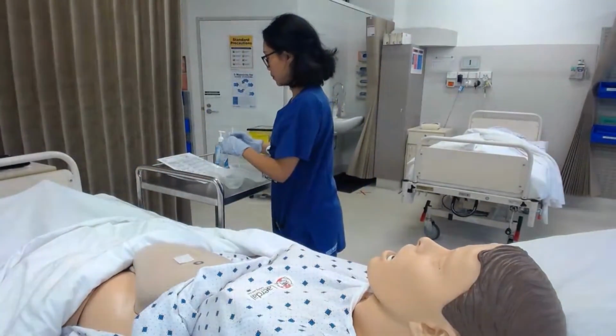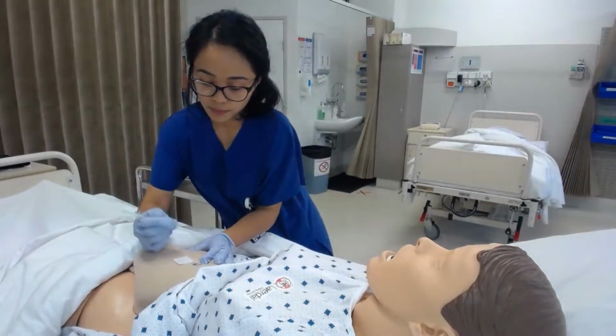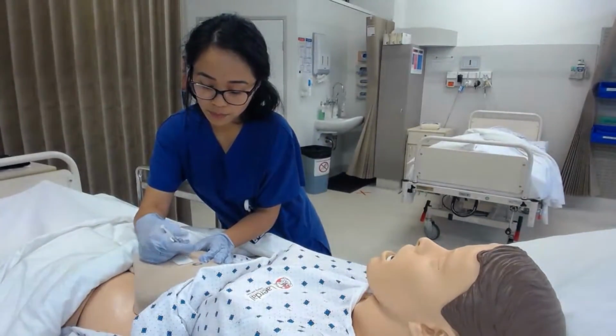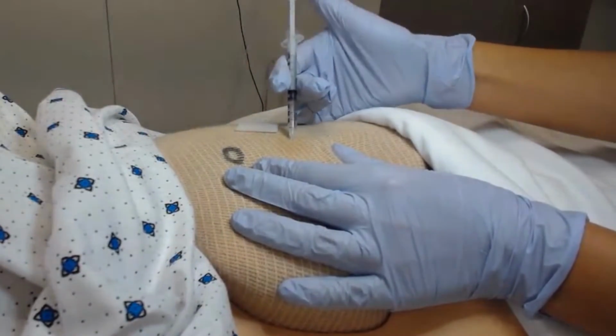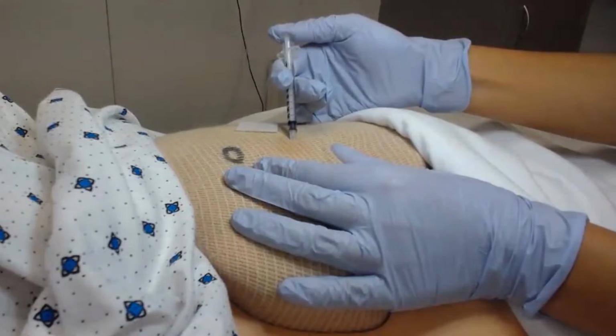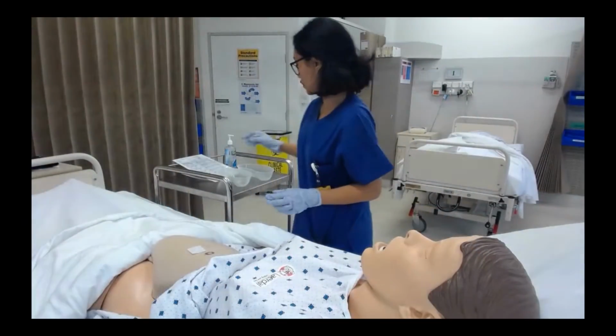Remove the needle cap from the needle by pulling it straight off. Hold the syringe between your thumb and forefinger of your dominant hand. Inject the needle quickly and firmly at a 45 to 90 degree angle. Place the exposed sharp straight into the kidney dish with the broken glass vial.